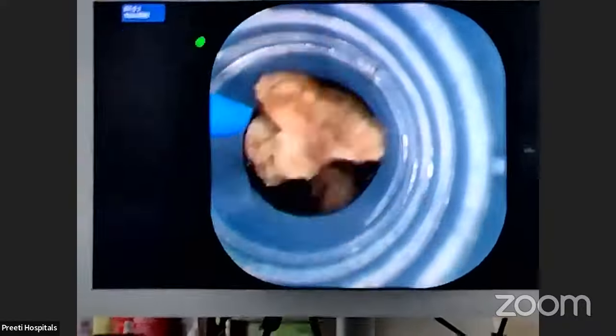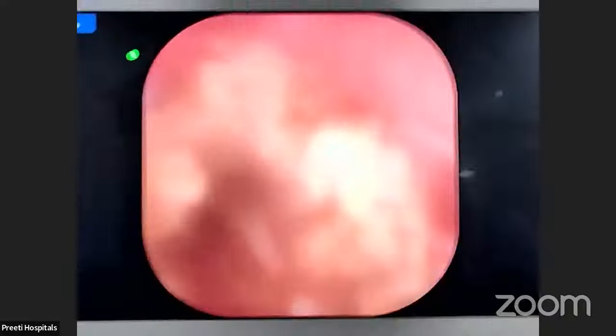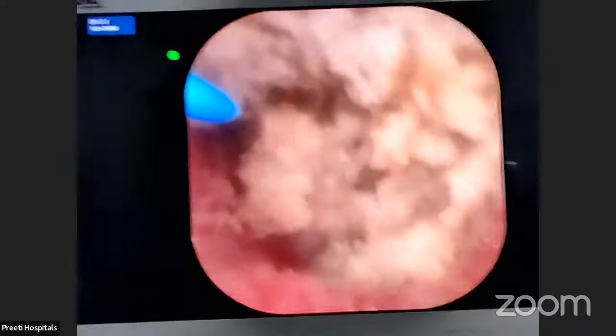See, you can activate once or twice like this, not too much. So he pushed inside smartly. Pushing inside and working inside the kidney is highly beneficial. One more question, sir. Yes. Slippage of the access sheath while doing the procedure. How to avoid it? Good assistant.